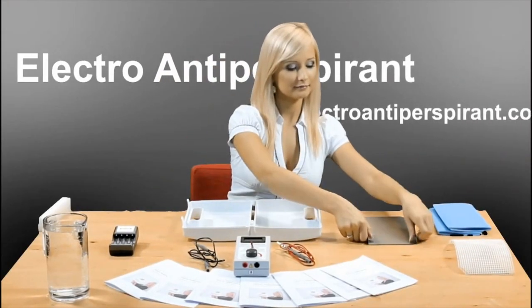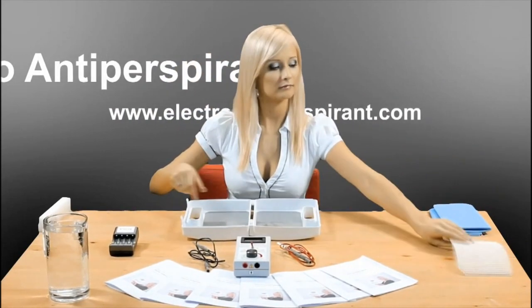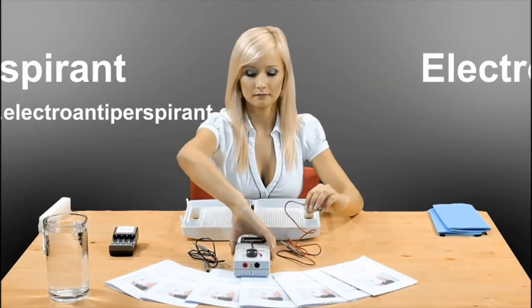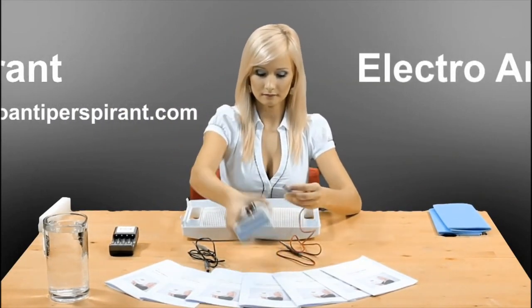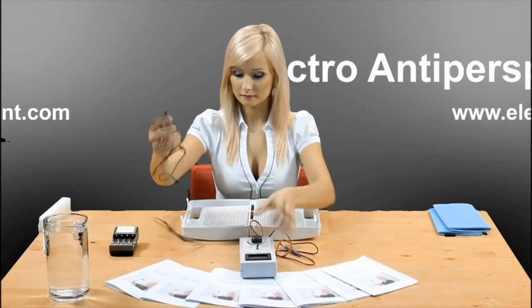It is very easy to get the device to work — everybody can do it after having read the instructions for use. The device can be used by patients of all ages. Electro Antiperspirant cannot be used by people having metal orthopedic implants, pacemakers, or pregnant women. Read the instructions for use carefully.